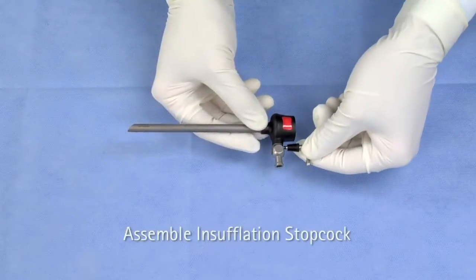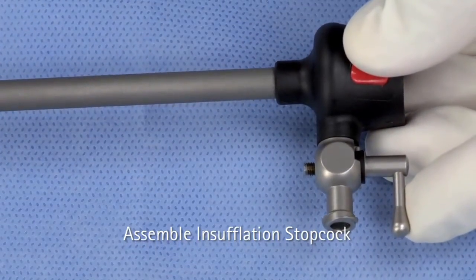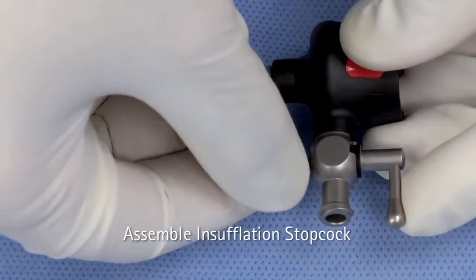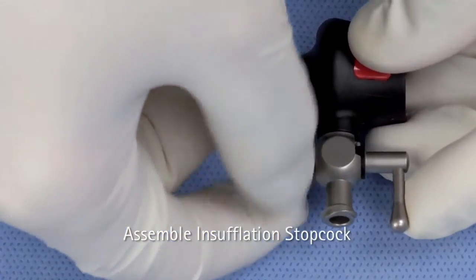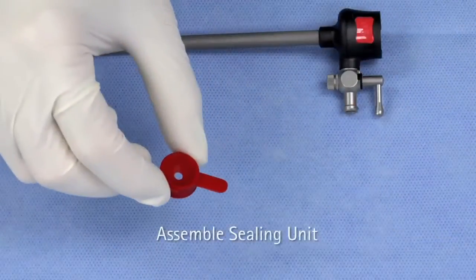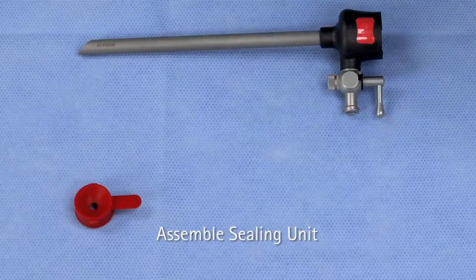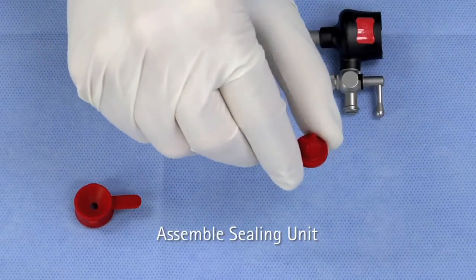For trocars with insufflation, install the stopcock into the insufflation valve and screw on the spring cap. Next, inspect the sealing cap and the cross-slit valve of the sealing unit. If any cracks or tears are found, the components should be replaced.